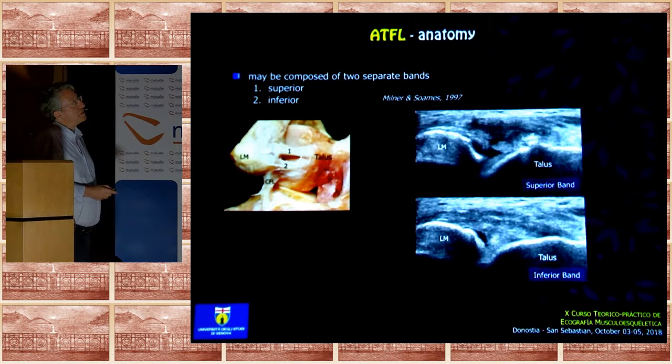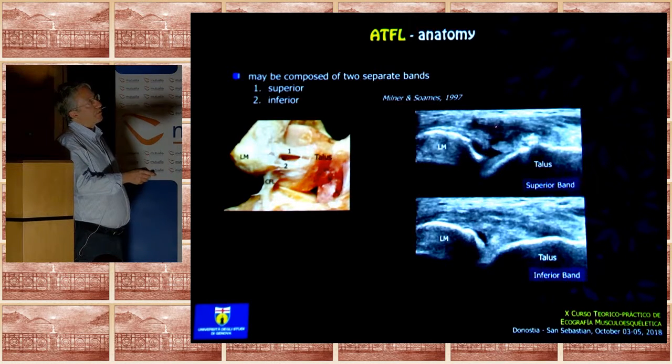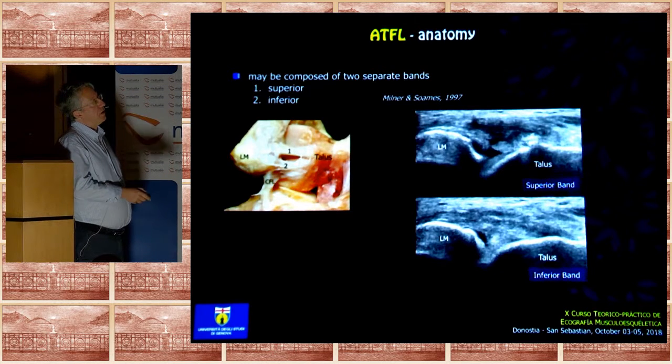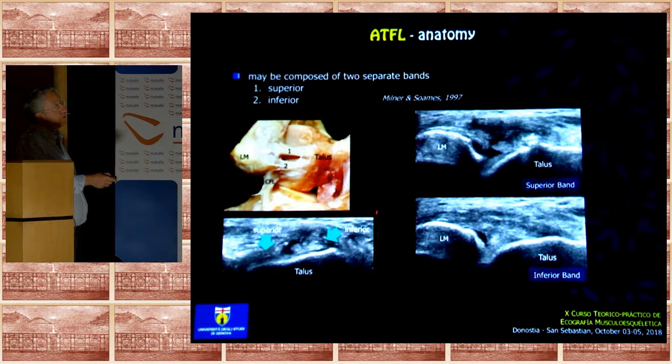So in some instances, the upper part, that is the most biomechanically exposed, may be ruptured. And when it's ruptured, you have a break in the capsule, and the fluid located at the level of the joint migrates up into the soft tissues here, superficial to the ligament. Then you go down and you see the inferior part of the ligament, very thickened, but not completely torn. This is the transverse image, the short axis image of the two components, one absent, the other one very thickened inferiorly.